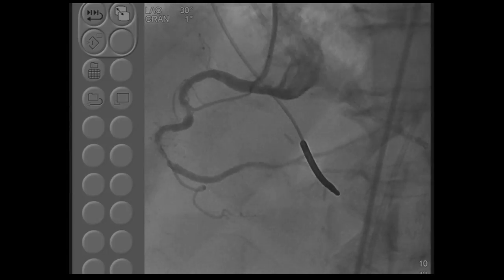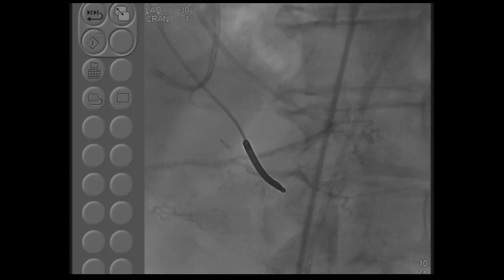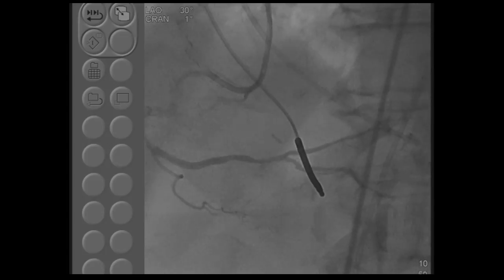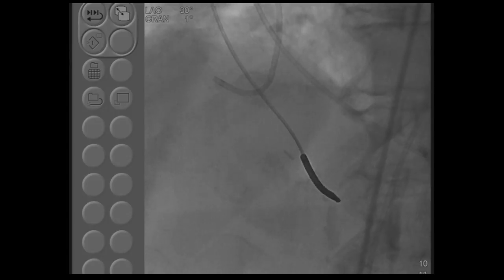Very heavily calcific lesion. I'm sure you can appreciate that. Also LAD is very heavily calcified, and this is where we will be using a Fine Cross and Fielder wire, change it to Rota, and meanwhile within next 10 minutes I make my presentation of the 2 points, and then we'll be ready for rotational atherectomy.